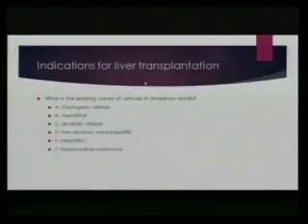Okay, moving on. So the learning objectives, we're just going to talk informally about indications, contraindications, types of liver transplantation, main goals in preoperative imaging in both the recipients and in live donors. And then we'll talk about use of the different modalities briefly. Okay, so a lot of this is in question and answer format.